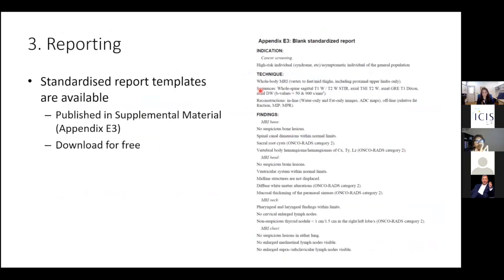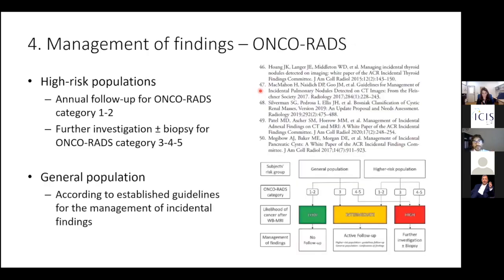Third point of the guidelines, we try to address the reporting because we know that it is difficult to report. We do not need to write big books, just small reports, very well organized. We tried to standardize the report by providing templates that you can download for free in the supplemental material of the publication, trying to make reports standardizable and more comparable also for future studies.